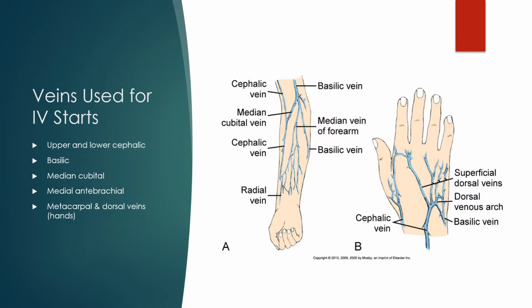So we need to find a good place to start our IV. We start by going to the furthest place away from the body as possible, the most distal. We start by looking at the hand. A couple of considerations with the hand. When we think about the hand, this is a high area of getting hit. Think about your patient going to the bathroom, all the risk factors and the areas in the bathroom that are hazards to bumping that IV against something.